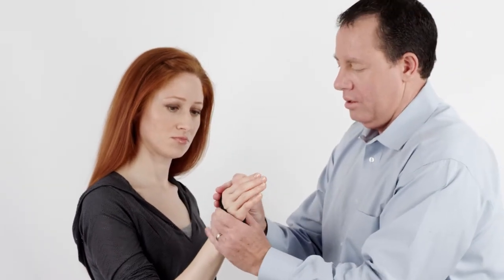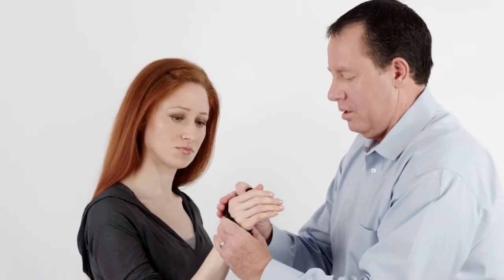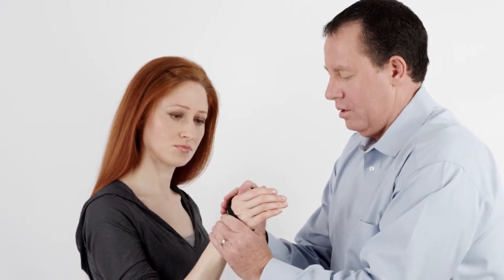Gently mold into the desired position. The STS-2 should be firm in 1.5 to 2 minutes.